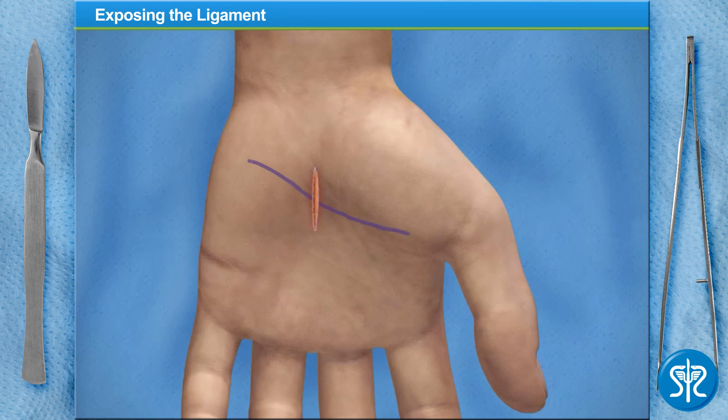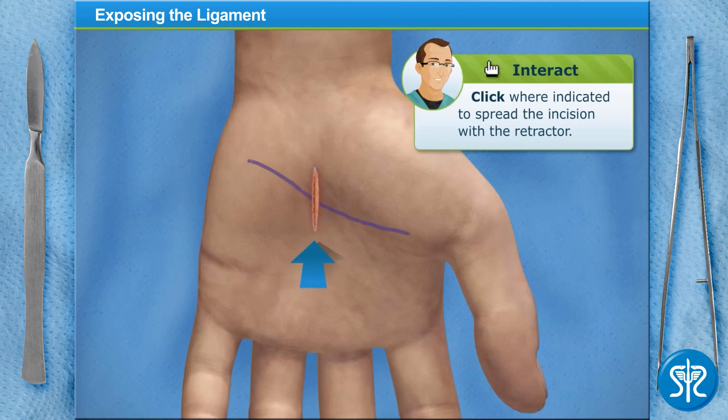Now we'll spread the incision wider to expose the transverse carpal ligament. This band of tissue is the cause of the problems. Place the retractors into the incision and spread it open.